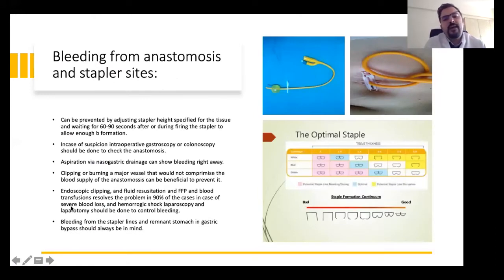But what can we do if we have bleeding from the trocar site and we need some time, or we have to finish the surgery? Sometimes you cannot control the bleeding and you get nervous. My idea, which I took from the literature of a Turkish surgeon, is to put a simple Foley catheter into the port site and do a compression. It's a simple method from laparotomic surgery. You can put it in a port site which is bleeding aggressively, maybe from a branch of the epigastric artery. You put in a Foley catheter and stop the bleeding, finish the surgery, and then you can open the trocar site and control the bleeding by cautery or by tie.